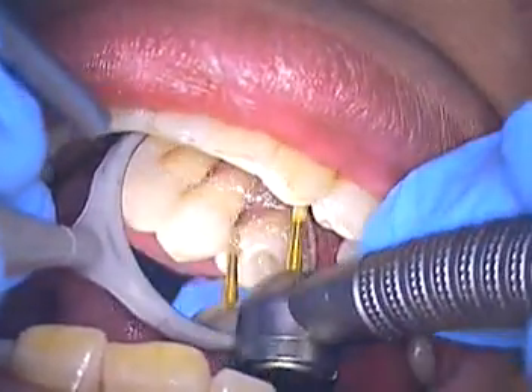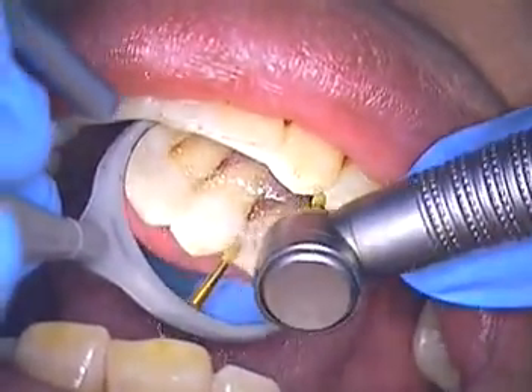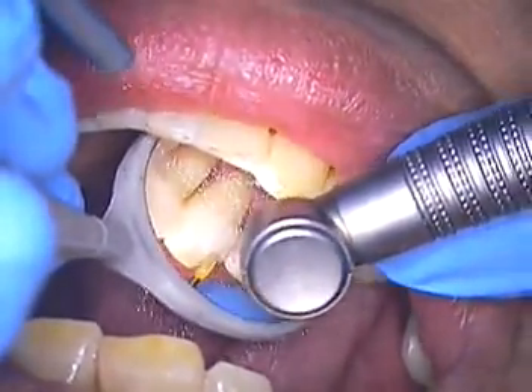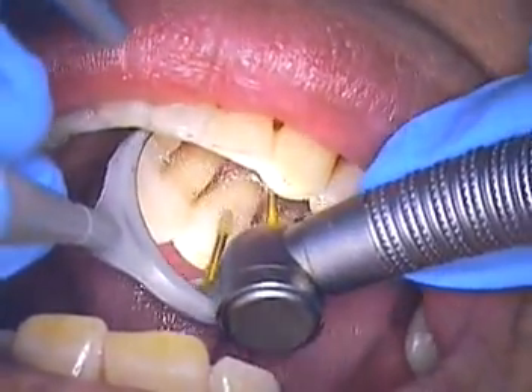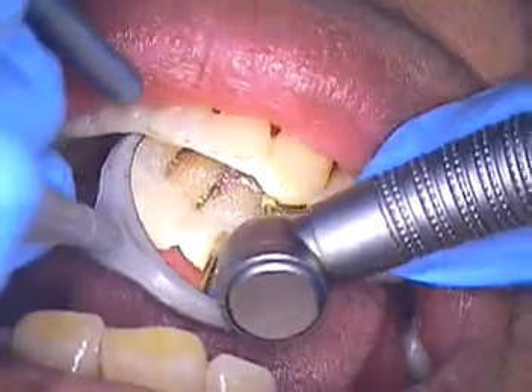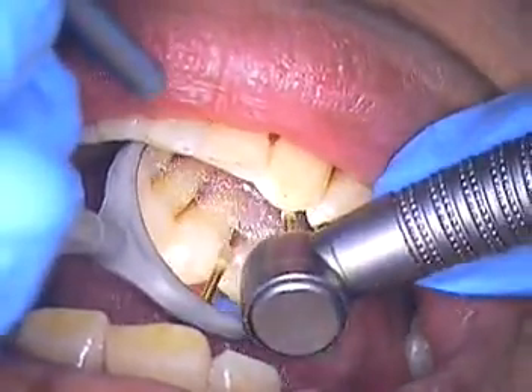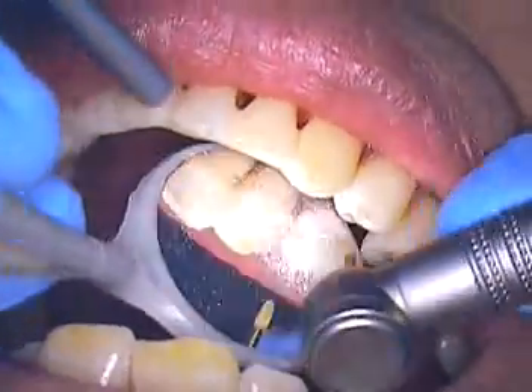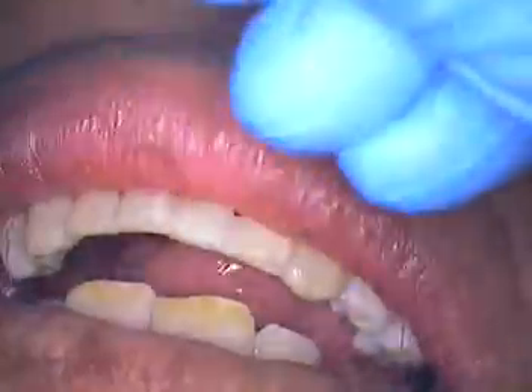The tongue will compare one side with the other almost immediately. I bulked it out a little bit on this corner. You could handle some of this next week or you can get it now, and we can just reduce a little bit more — I don't want to over-reduce. There's another spot that I can get to, but that should start to feel better. A little better. So we'll bring a little bit more in. There's a little sharp spot I see that I can take care of.